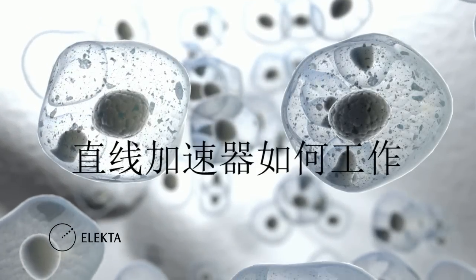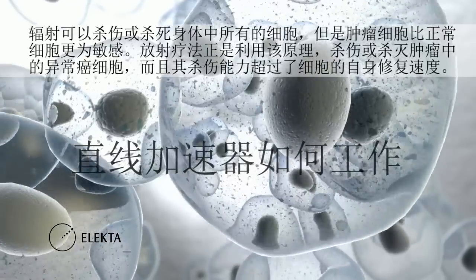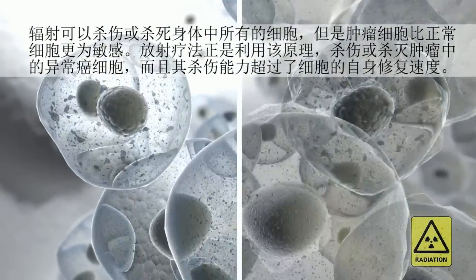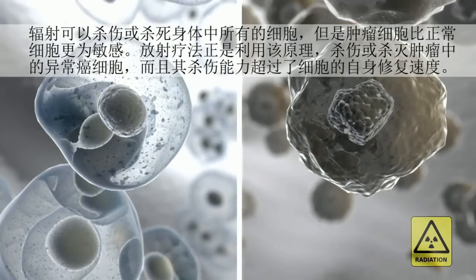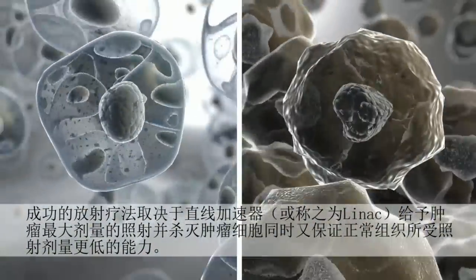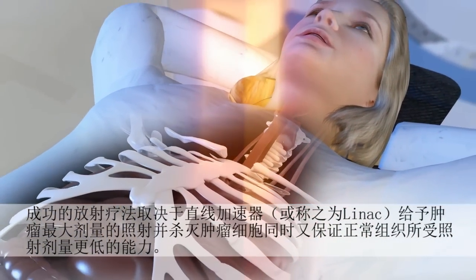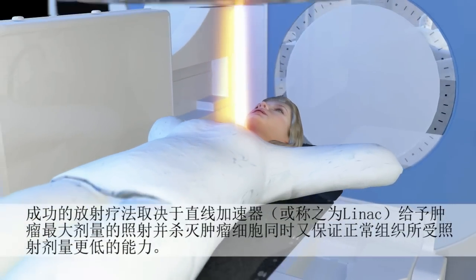How the Linear Accelerator Works. All body cells can be damaged or killed by radiation, but tumor cells are more sensitive to radiation than normal cells. Radiation therapy uses this principle to damage beyond repair or kill the abnormal cancer cells in a tumor. Successful radiation therapy depends on the ability of the Linear Accelerator, or LINAC, to deliver a tumoricidal dose of radiation to the tumor while ensuring minimal radiation of normal tissue.